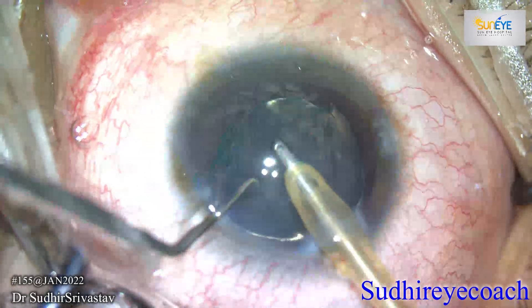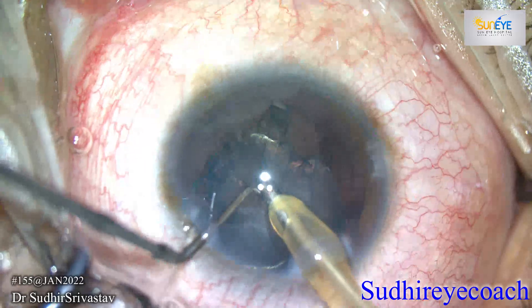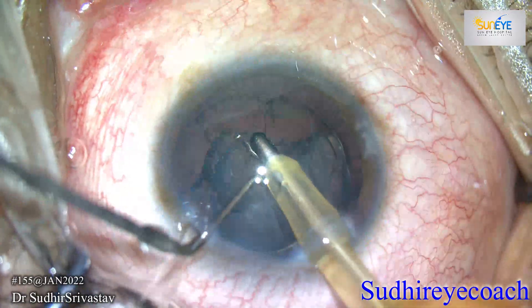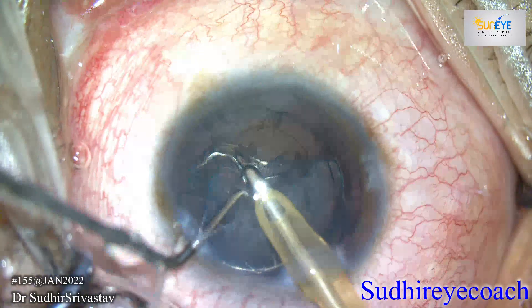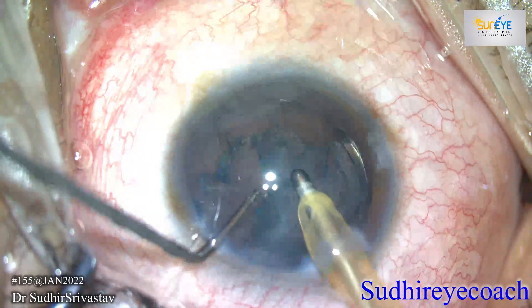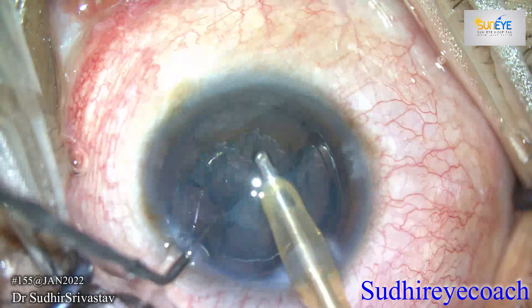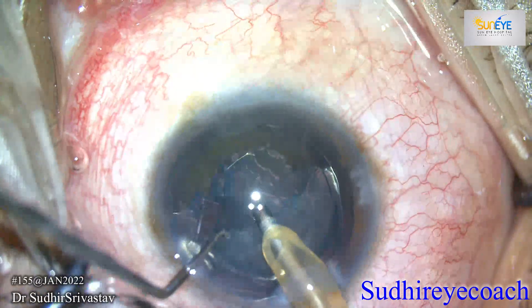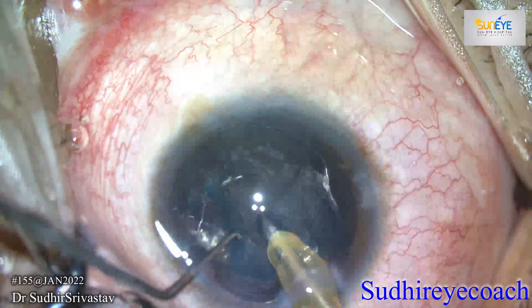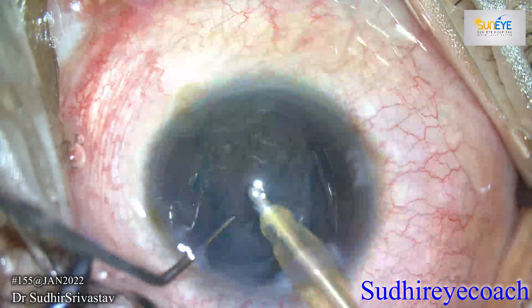Since the patient was young, there was no hard nucleus, so I started aspirating the nucleus with an irrigation-aspiration cannula. I made all efforts to maintain the anterior chamber pressure gradients, because a sudden change in the anterior chamber can enhance the possibility of vitreous movement through the weak and lax zonules.